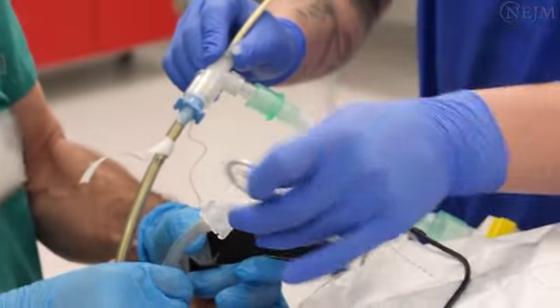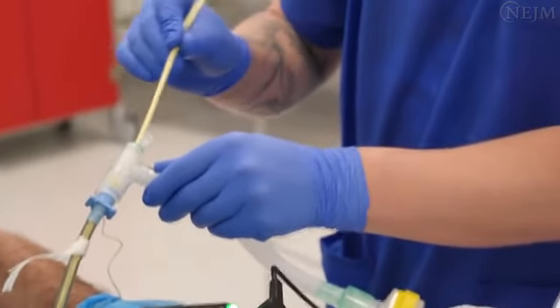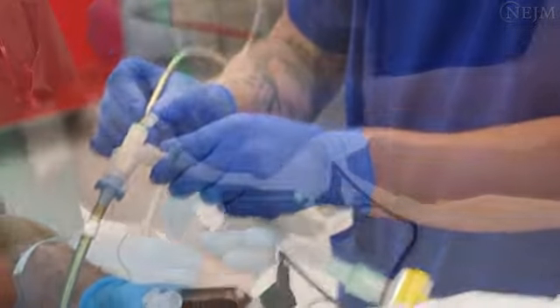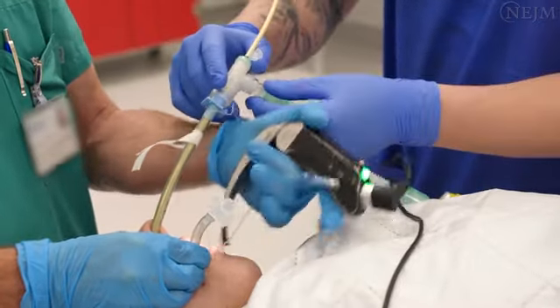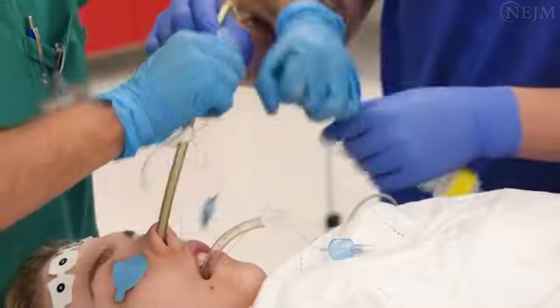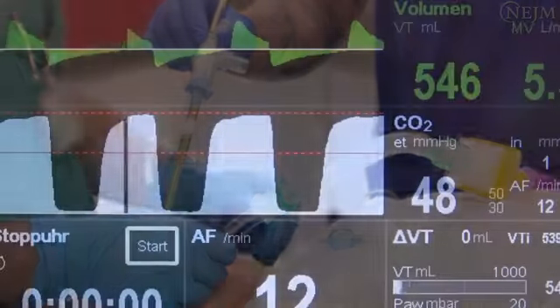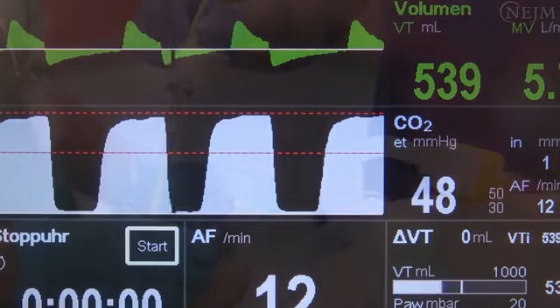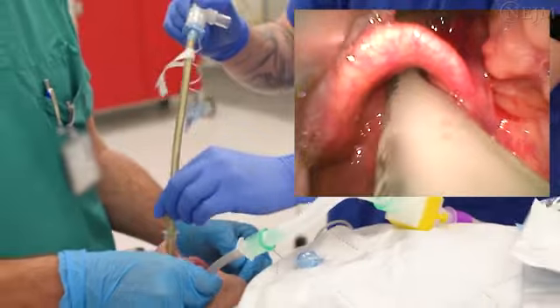Remove the stylet. Withdraw the airway exchange catheter to the level of the hypopharynx. Inflate the cuff of the oral tube, then remove the laryngoscope. Check the anesthesia monitor for a carbon dioxide tracing, then completely remove the airway exchange catheter and the nasal tube.